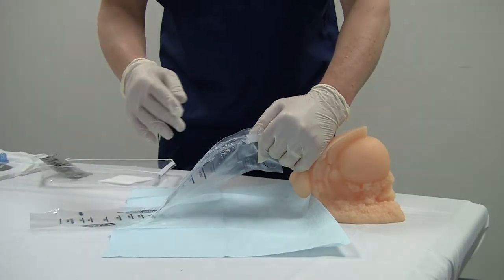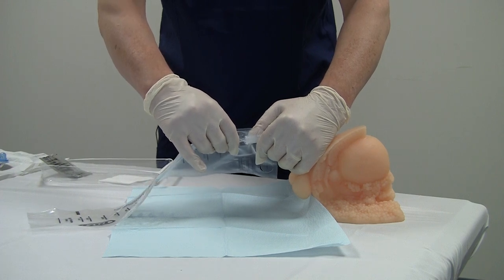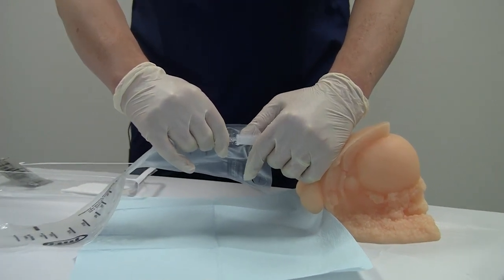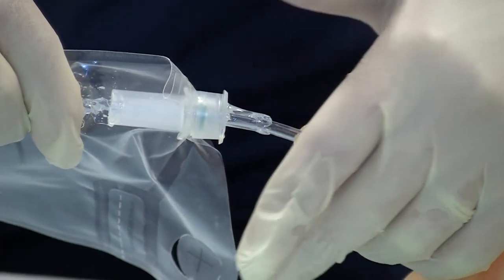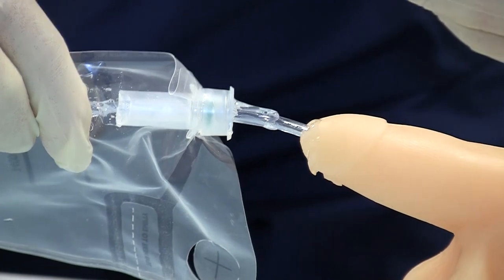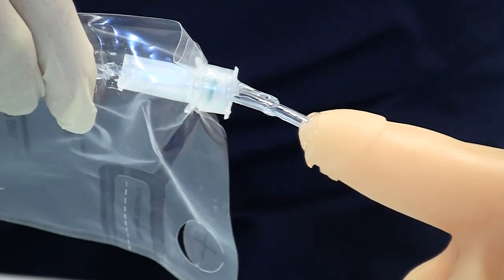When the patient finishes voiding, take the catheter again at that 1400 cc mark, grab tight here, and just pull the catheter out about 1 inch. See if we have any more fluid. And you'll notice I've let go of the patient. I don't have to hold on to the anatomy any longer.